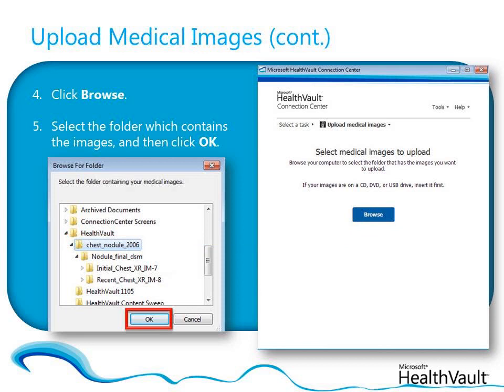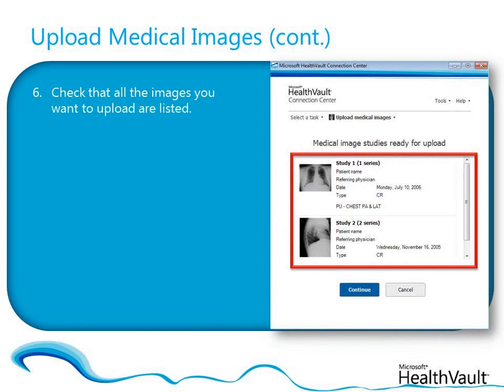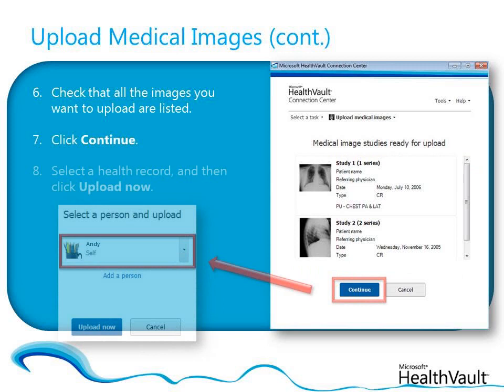Connection Center will detect and display all of the medical image files in the folder. Check that all the images you want to upload are listed, and then click Continue. Select a health record in your HealthVault account to upload the images to, and then click Upload Now.